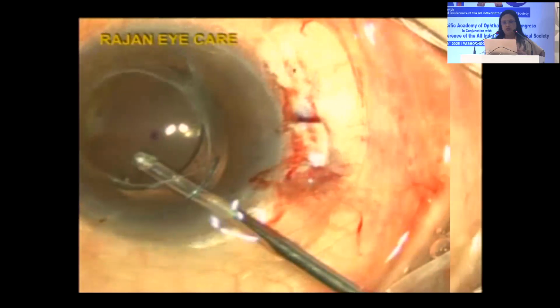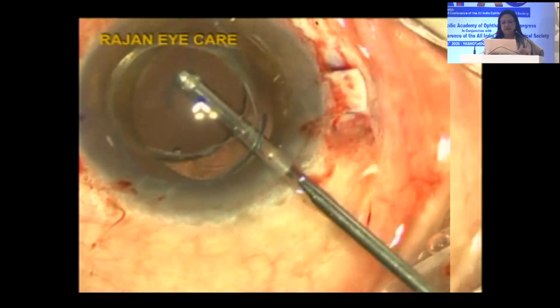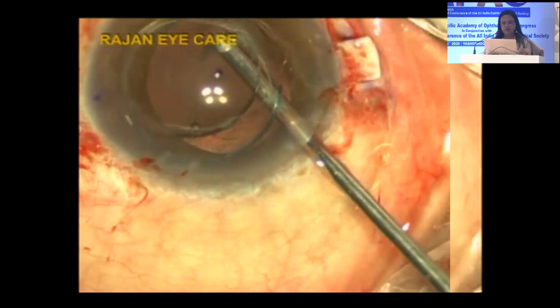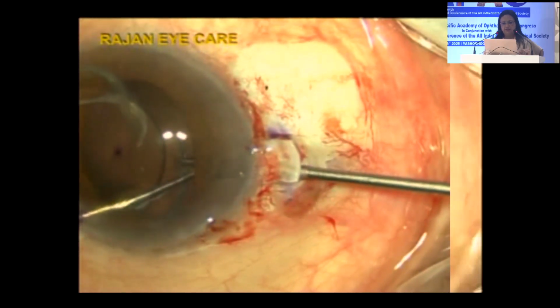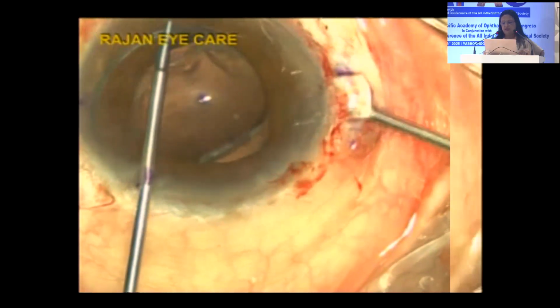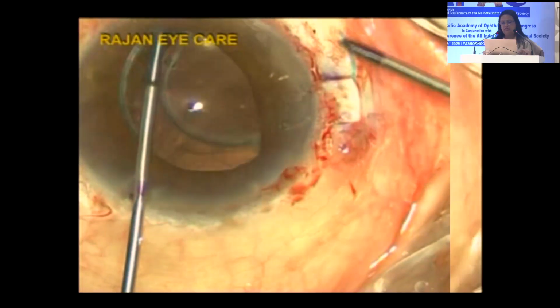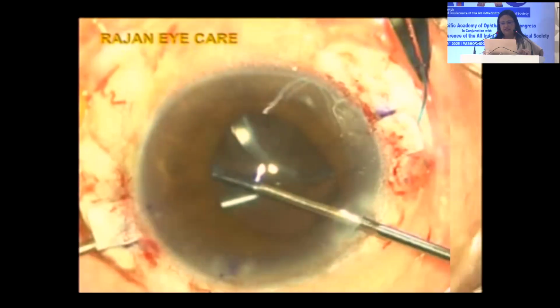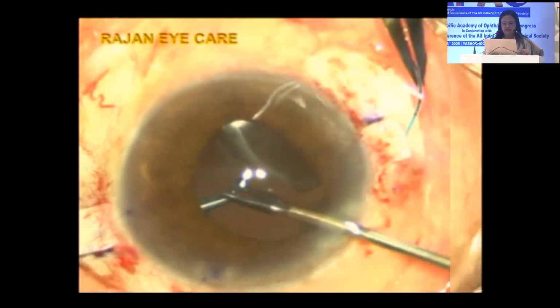So basically, we want to remove the lens out of the bag. Initially I'm just creating a posterior capsule opening, eating away the posterior capsule. And now I'm feeding the lens in what is called the handshake technique. I've just exteriorized one haptic. At the same time, I'm holding the lens on the other side. And you can see now I'm exteriorizing the other haptic.